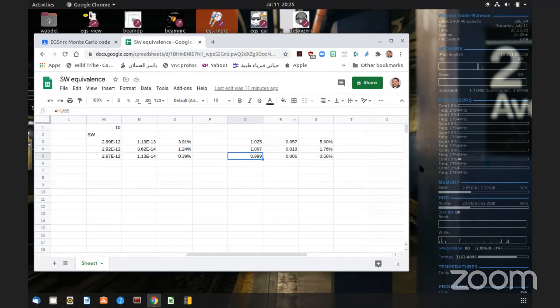I mean, we cannot conclude, because in our practice we don't use copper in a patient, in a phantom. It's something we place away, just to attenuate the beam. But with Monte Carlo, you can investigate whatever geometry you want. This is the beauty of it. This is the strength of it. So I don't know if that method actually gives you an equivalence of shielding. I don't know.